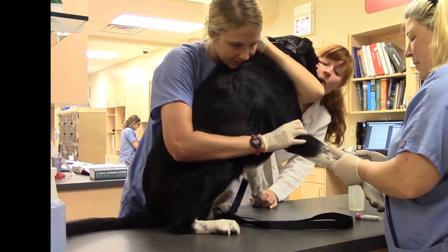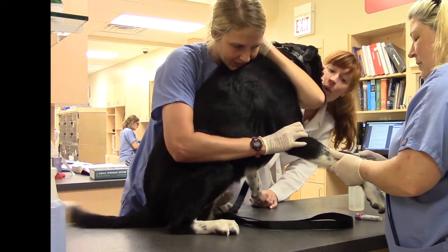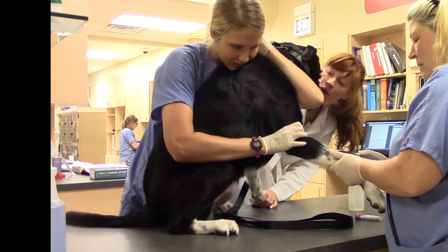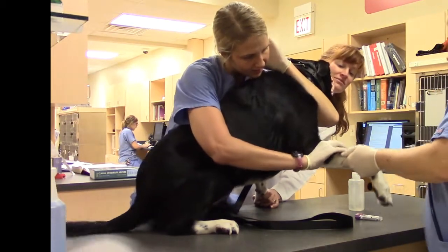Drawing my sample. It's okay. Great job, Sarah. Good. Getting there, getting there. Okay, let up Sarah. Put pressure over the brow.